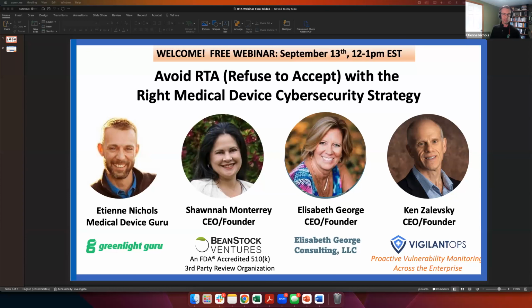And so some of you may be thinking, okay, well, why are we here exactly? What is this RTA? Well, on December 29th, 2022, the Consolidated Appropriations Act, also known as the Omnibus, was signed into law. One part of that omnibus was ensuring cybersecurity of medical devices, which amended the FD&C Act to ensure cybersecurity of medical devices. If you look at that guidance document, if you skip down the FDA's page a bit, it said the FDA generally intends not to issue refuse to accept decisions for pre-market submissions submitted for cyber devices based solely on information required by Section 524B of the FD&C Act before October 1st, 2023.